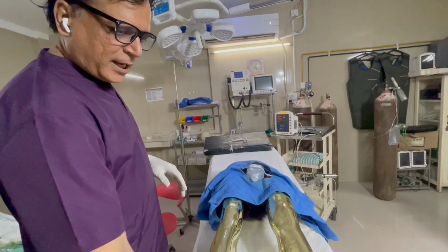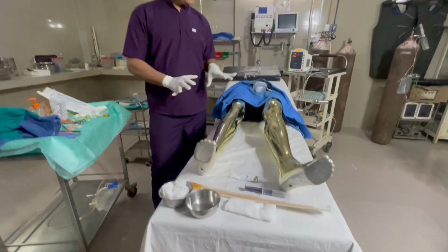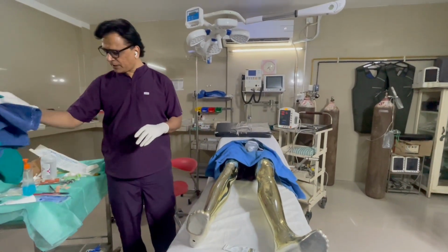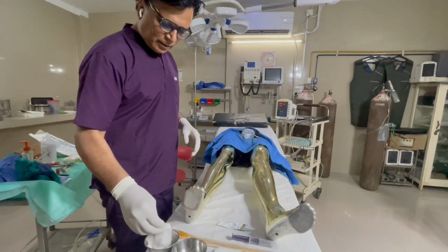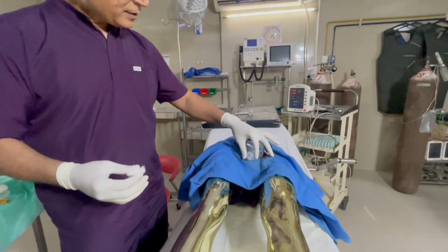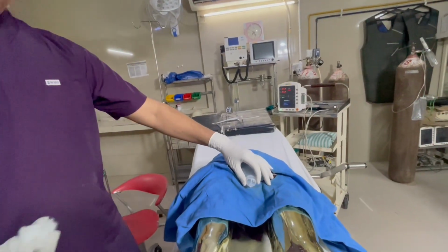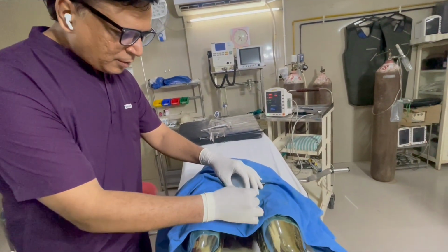So first of all, if it is already draped, then it's okay. If it is not draped, I will first clean, first retract the prepuce. I will be retracting the prepuce and then cleaning around the prepuce with the swab.